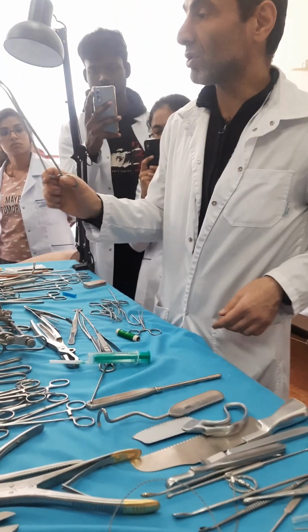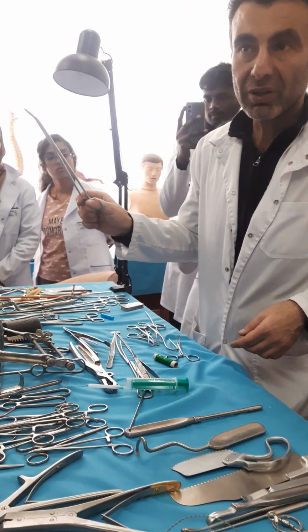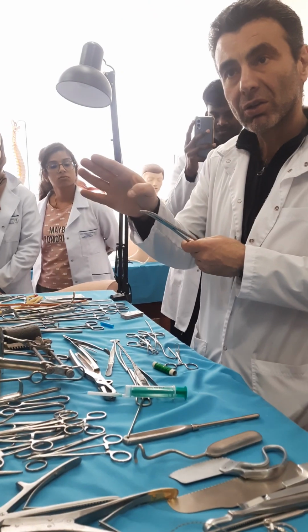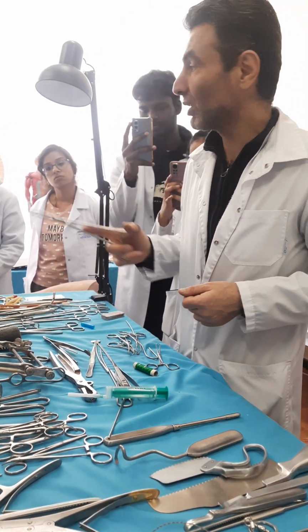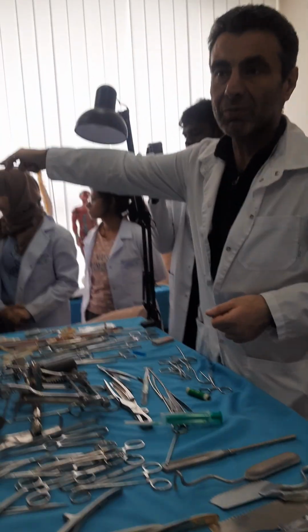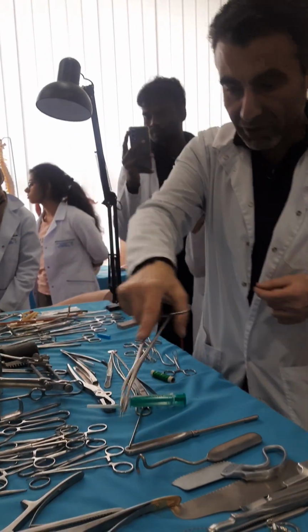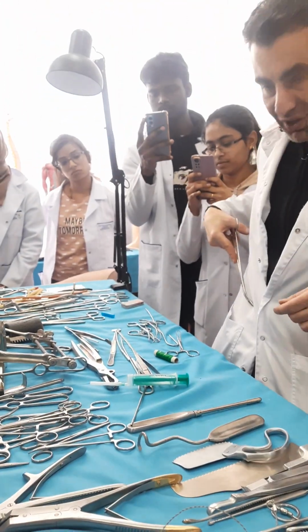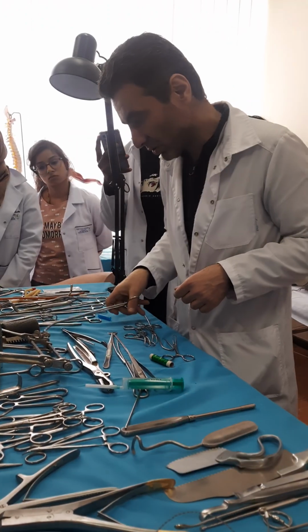Very big instrument. We call it Kornzang. Kornzang, this is a German term. Kornzang can be straight, Kornzang can be curved. Usually it is the nurse's instrument. She takes it from the Bix. Bix is the metal box for sterilization of instruments. She takes the instrument and puts it on your table. Sometimes we use it to make a tunnel through structures, but it is not so usual.